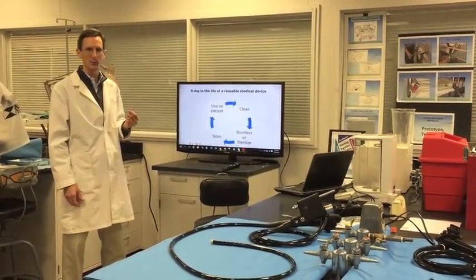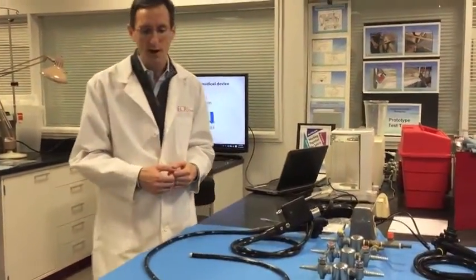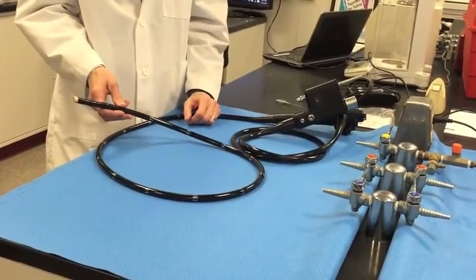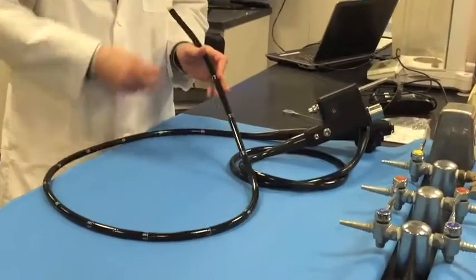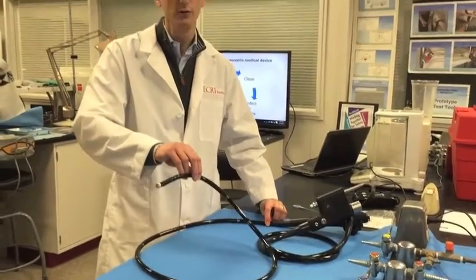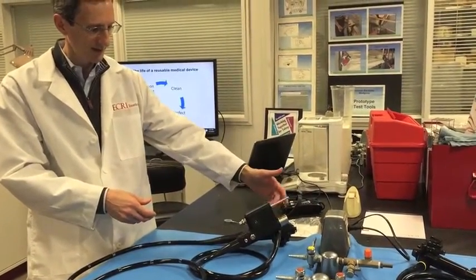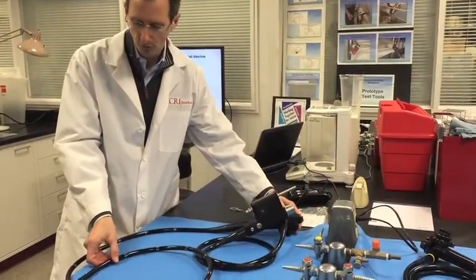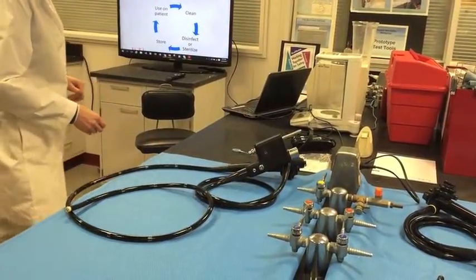Cleaning endoscopes is a particularly challenging task. This is a colonoscope — one of the more basic types of flexible endoscopes. On the surface it looks easy to clean; you've got a smooth surface that can be wiped down. The part from here to the end is inserted into the body; the rest remains outside and connects to a device that produces a light source and a camera. The controls for maneuvering the tip of the scope are up here, along with ports.